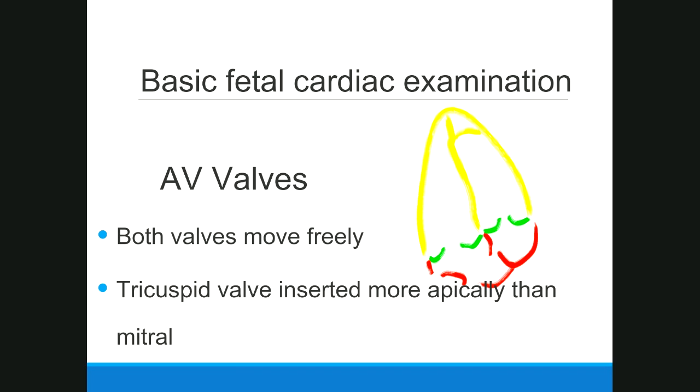So again, following up with some more information with this basic fetal cardiac exam, we looked at the position of the AV valves, and we also just want to make sure that they're moving freely. If they are really echogenic and they don't look like they're opening and closing, well, you don't see what looks like hands clapping. That's how a lot of my patients have described when they see their heart valves moving, hands clapping. If they don't look like they're moving freely, if they look very stiff, that's something that we need to document. Out of concern for congenital stenosis of a valve.